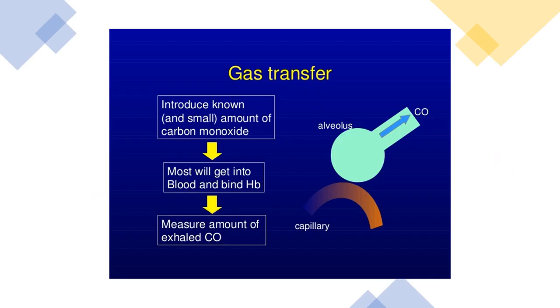So what we're doing is giving this small amount of carbon monoxide, remember, 0.3%. I just don't want you messing up that question. Most of it will get into the blood and bind to the hemoglobin.